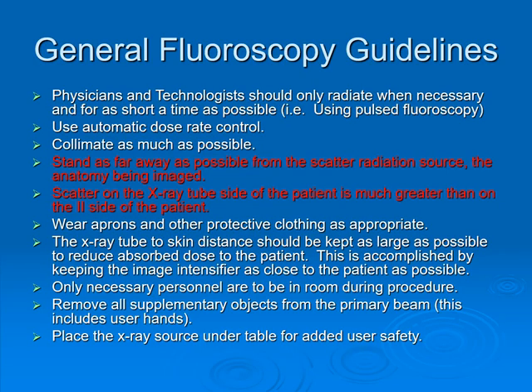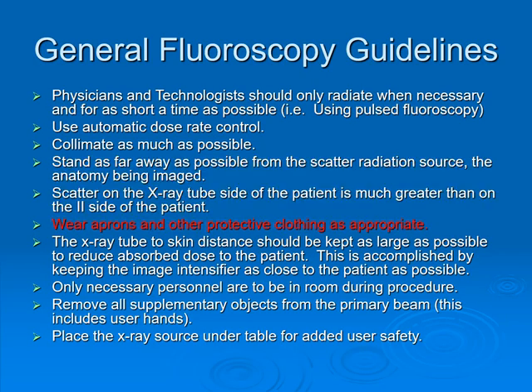This is the anatomy being imaged. In addition, scatter on the x-ray tube side of the patient is much greater than on the image intensifier side of the patient. Wear aprons and other protective clothing as appropriate.